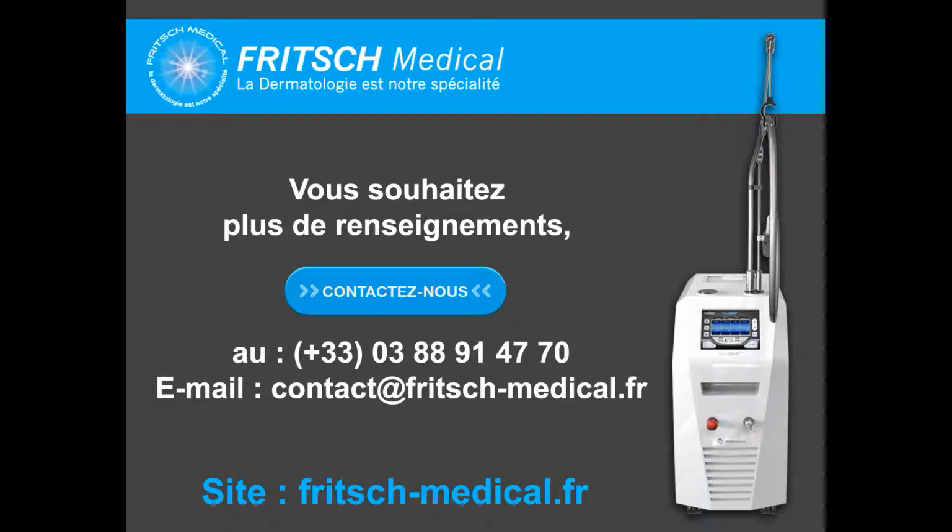But if you are very far from the orbit, you can also treat with 5 millimeters, because with 5 millimeters you can be sure that you destroy the whole size of the vessel, and you follow the vessel until the junction with the facial vein, and the temporal vein also. But be careful. On a periorbital vein, I think it's necessary to see another practitioner, to be sure the procedure is very precise and efficient.